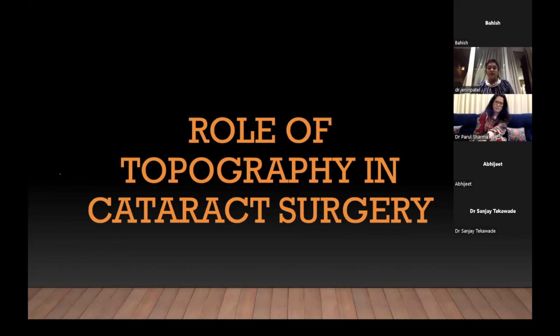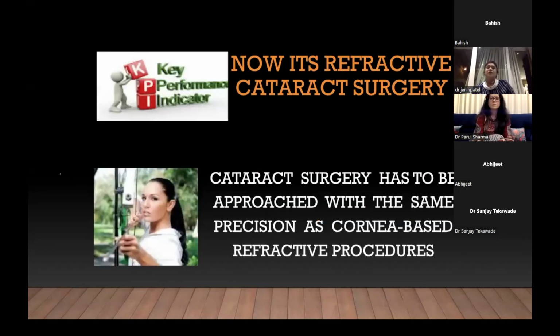So can we move ahead to the role of topography in cataract surgery? Yeah. Okay. So I think today what's happening with cataract surgery is that the patient walks into the OPD, we see him on a slit lamp for probably less than 5 minutes. Optical biometry is done, maybe on that same day or another day, and the patient is posted for cataract surgery.